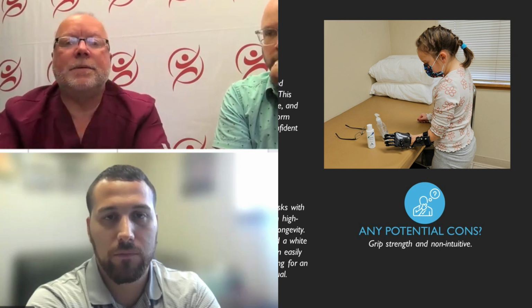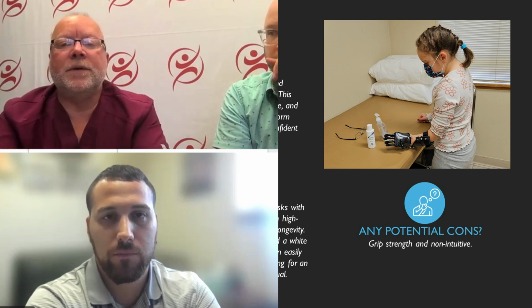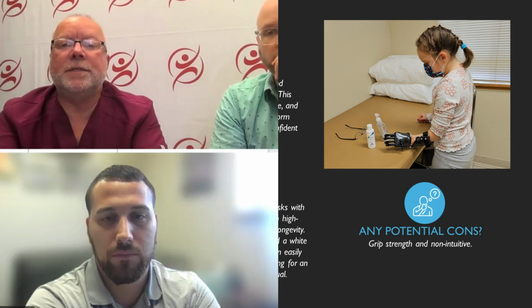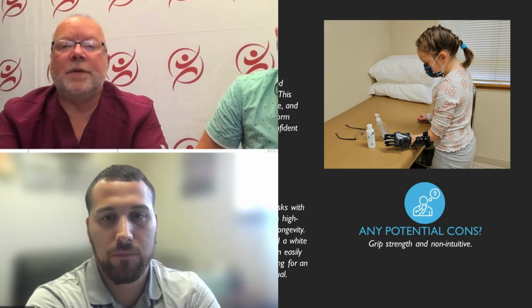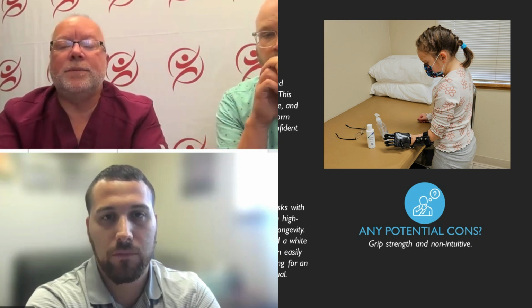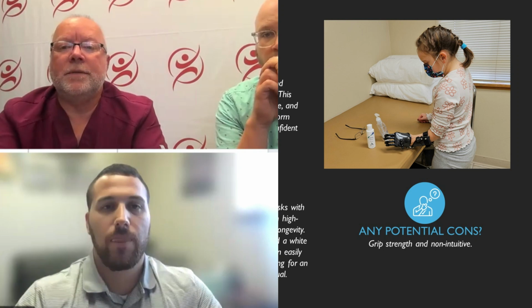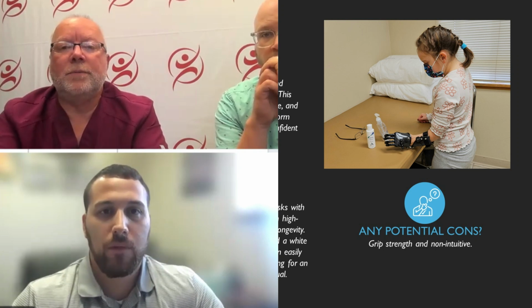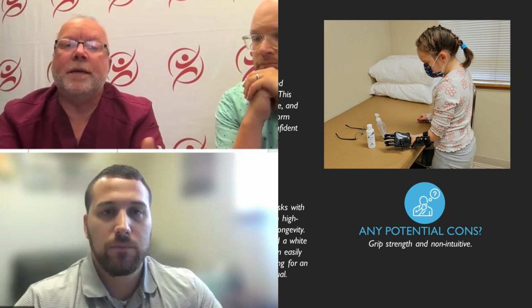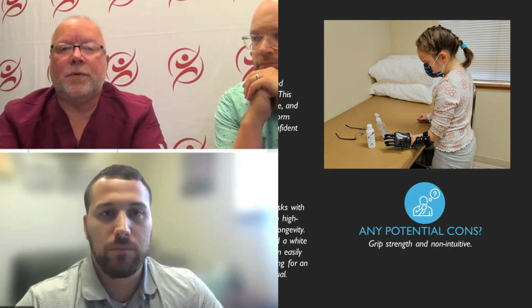I typically would not recommend putting this on anybody that's an adult, because the grip strength is not very good for these. But for a child like this young lady here is, you'll get to see that in the video. It does really well for her. And durability, that's why I would say I would only put them on kids too, because they're just not as durable. But whenever you have somebody that has that amputation level in a small hand, these are very good for them.